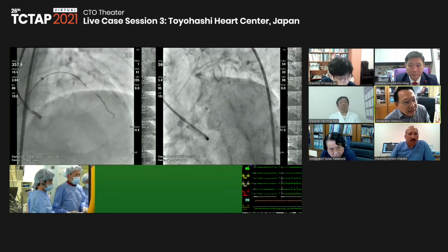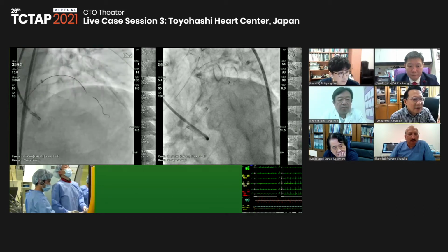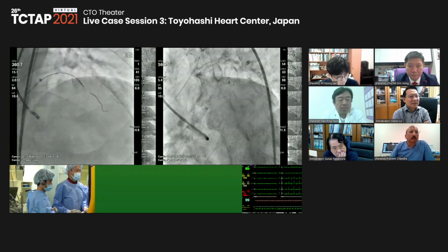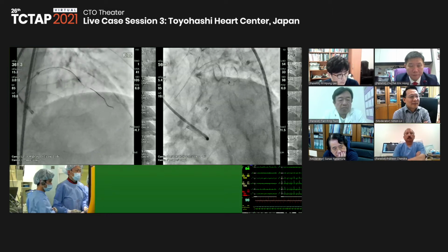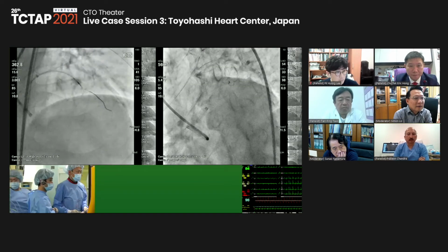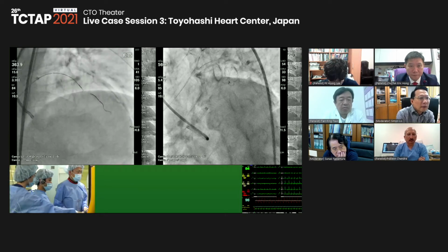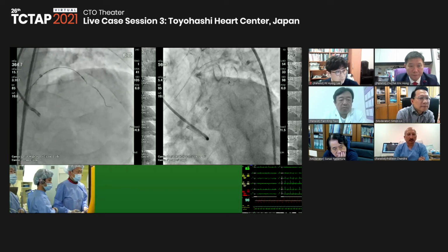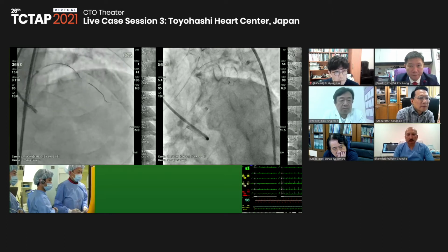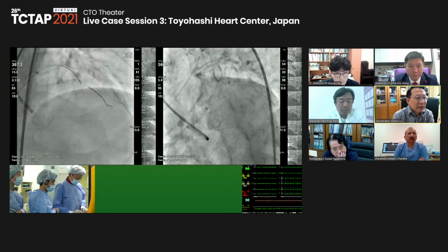Dr. Kenyan, can I just ask what wire you're using now for the LAD? I'm using the XTR. Oh, it looks good. And is the XTR inside a Corsair micro catheter?